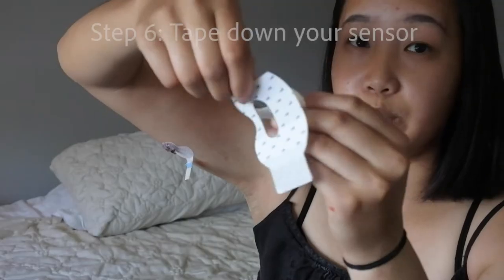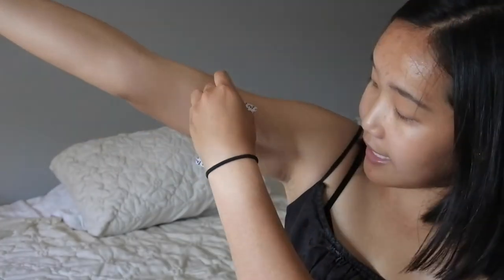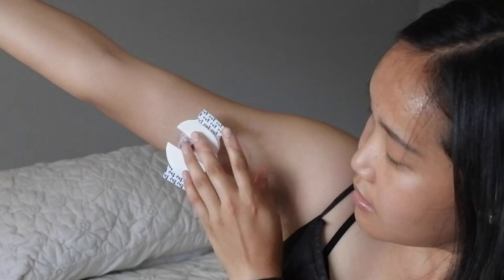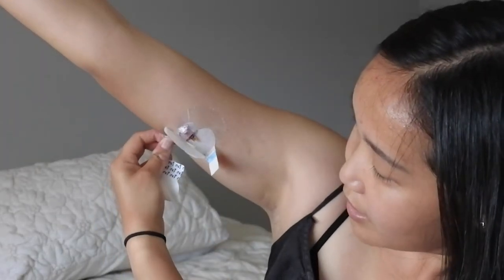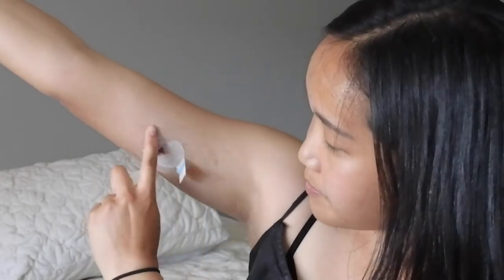My site stopped bleeding, so hopefully yours didn't do that. I think I just pushed down too hard. Basically, what you're going to do is get one of these oval pieces of tape. I remove the first piece, lay it down, then remove the second piece and put it down on the other side. It'll end up looking like this.